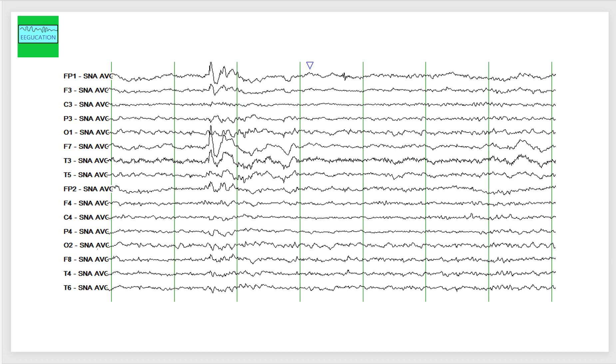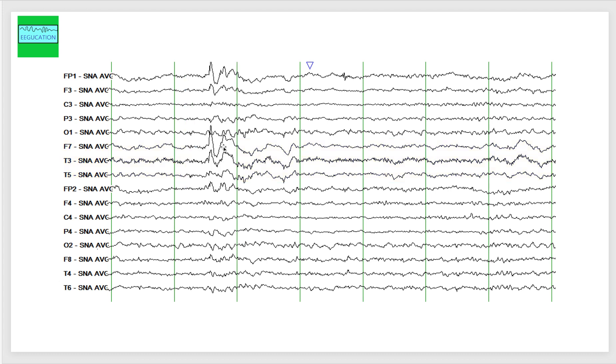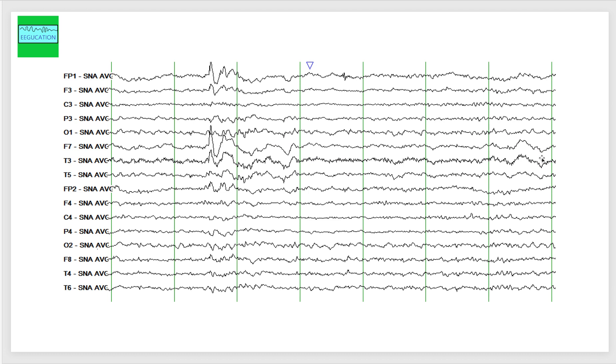This is yet another page from the same patient. Juicy spikes, juicy sharp waves, nice high amplitude sharp waves with sharp and aftercoming slow wave. There is a nice feel to it. It's not just F7. It also involves T3, involves F3, involves FP1. And then you have slowing that you see right after the sharp wave, but you also see independent slowing on the left temporal head region.